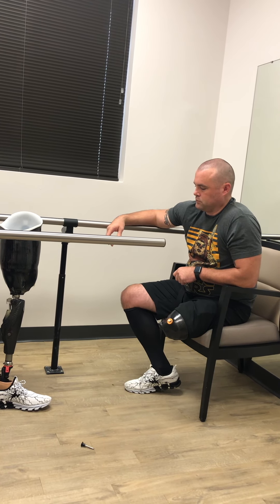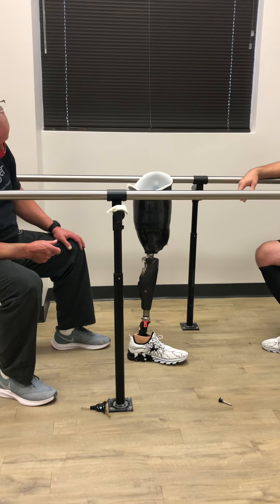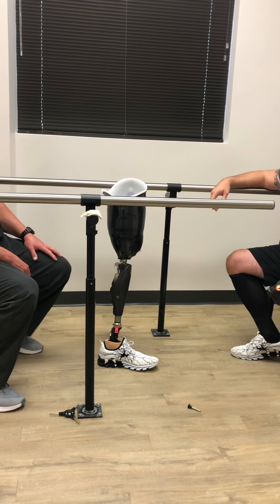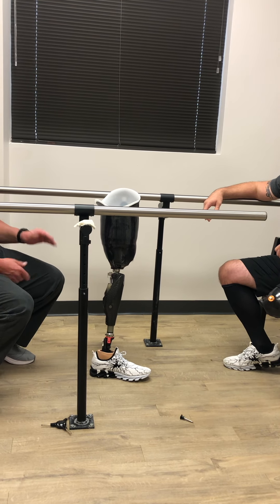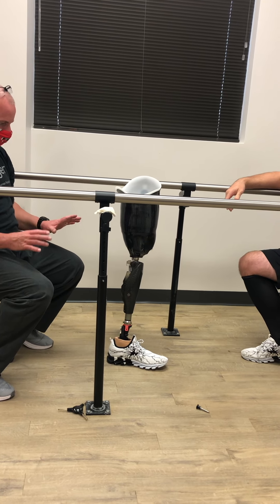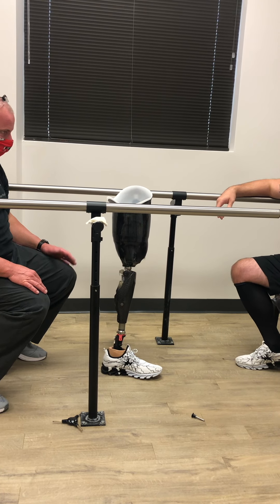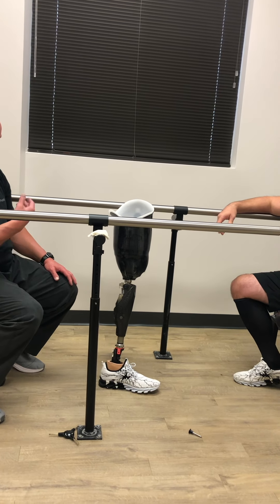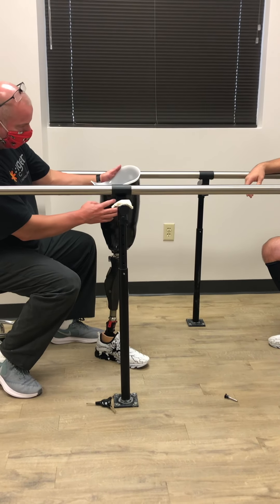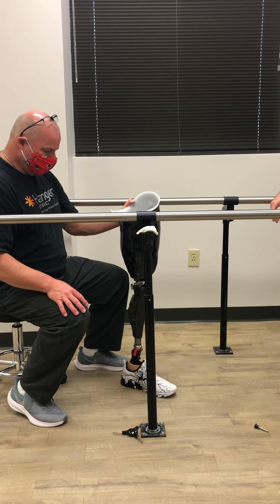I think we'll probably have enough room. I need an inch, maybe just a tad bit more, which looks like about what we have to put the rotator in here. Let's get you programmed and then we can see. I need more room for the foot and I just don't think we have it, but if I can get the rotator in there — let's get to about 90% and then I'll see if I can slide that in for you. It's pretty neat — I really would like you to have one. If we get the rotator in there, I still think it will help you with work, driving, being in the car, tight spaces. So give me about 15 minutes — I've got to grind all that off, hook the foot up, and get the programming started.